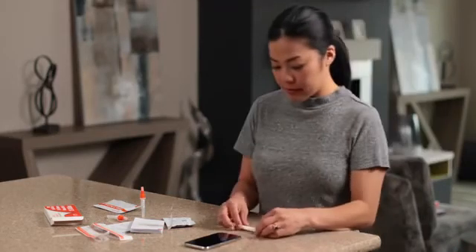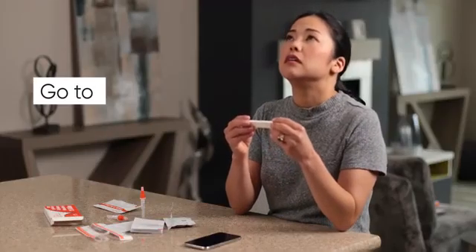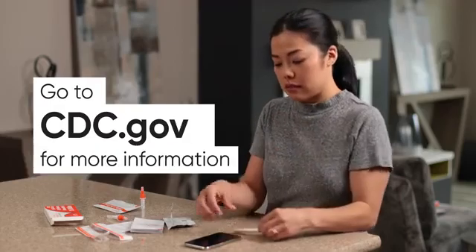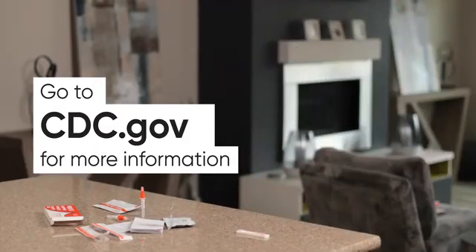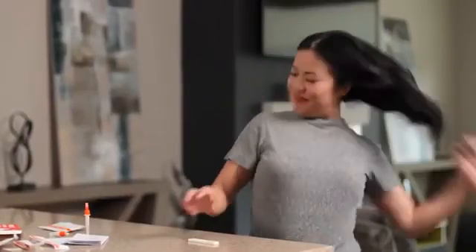If you tested positive, don't panic. Seek advice from a medical professional on your next steps. You can also go to cdc.gov for more information about how best to keep yourself and others safe. If your test is negative, be safe and get back to living that life of yours.